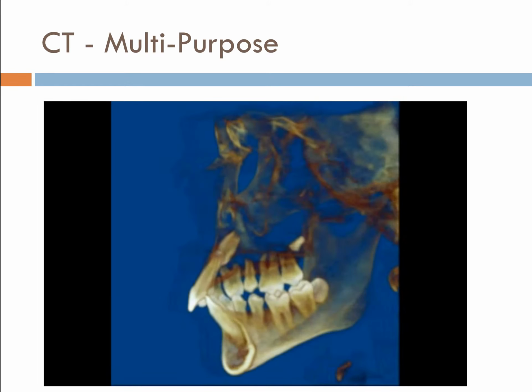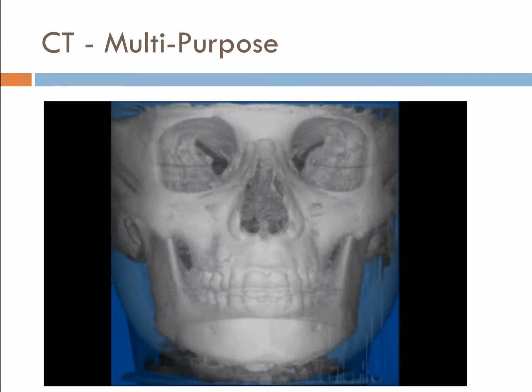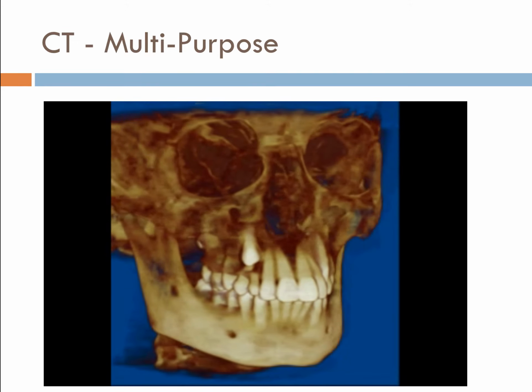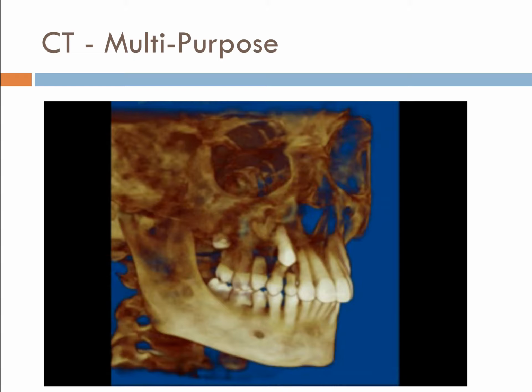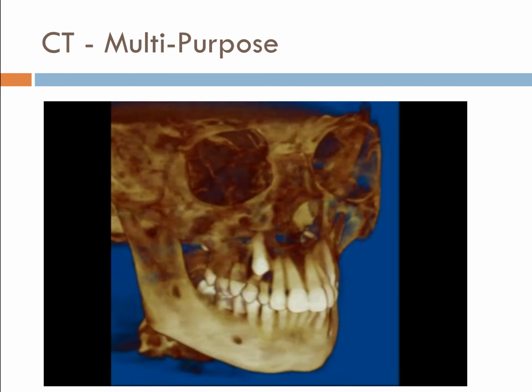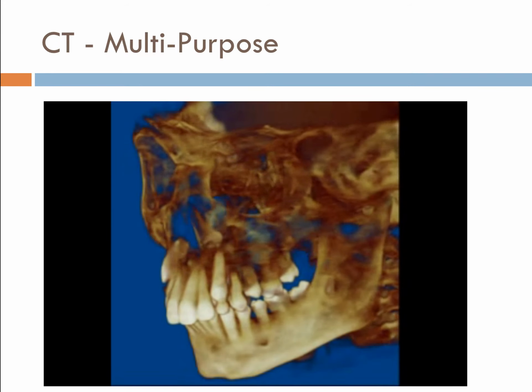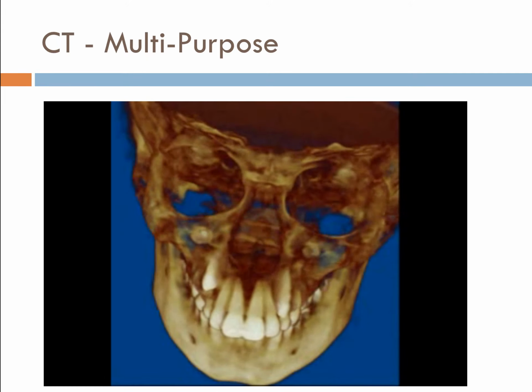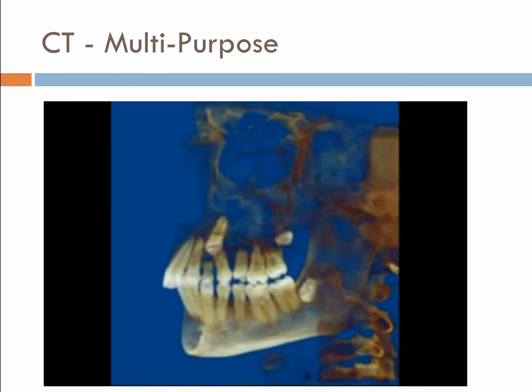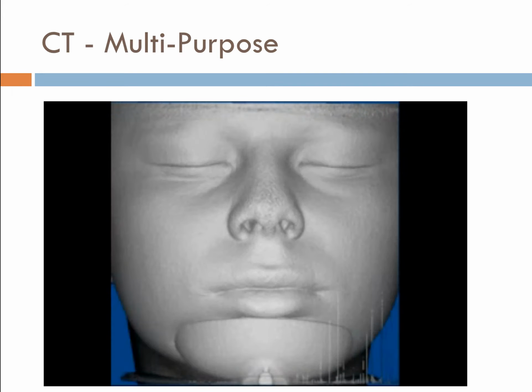This one's called Dolphin software that allows you to manipulate the images and look at them from various standpoints. It's a powerful technology, and I often refer to this as imaging for juries, and I don't make that claim lightly. It's about making medical imaging, which is seen as being high-tech, very highfalutin, bringing it to the same degree as you whipping out your iPhone and taking an image as well, and being able to manipulate those images and show them in formats that actually make meaning to a person having a look at them.